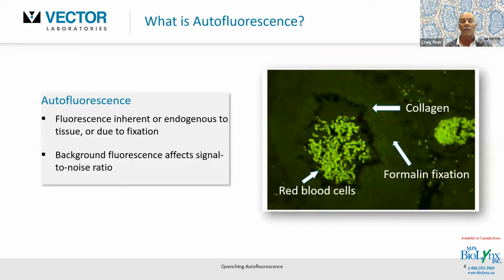For those of you who have tuned in here and might be looking to get into immunofluorescence, certainly be aware that some tissue does have these fluorescent components. And the image here on the right-hand side, I think, demonstrates that. So the fluorescence I'm referring to here is inherent or endogenous to the tissue preparation, and certainly might be also due to aldehyde-based fixation. And that might be through paraformaldehyde, 10% neutral buffered formalin, any of those aldehyde-based fixatives.